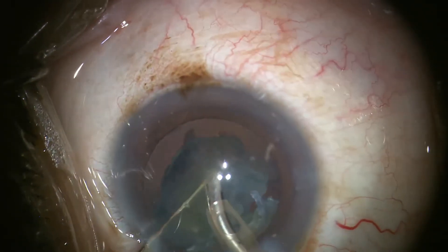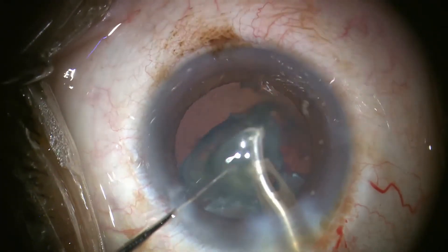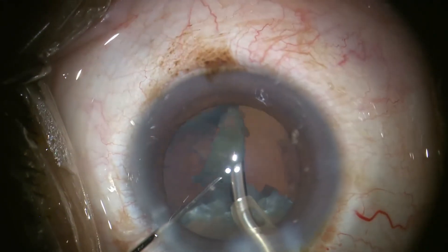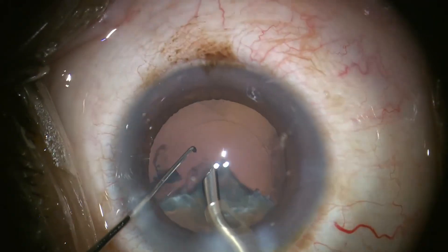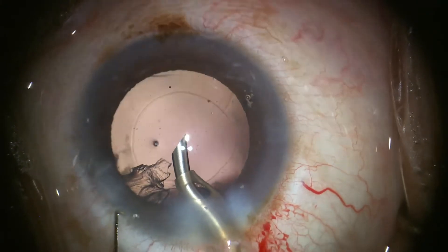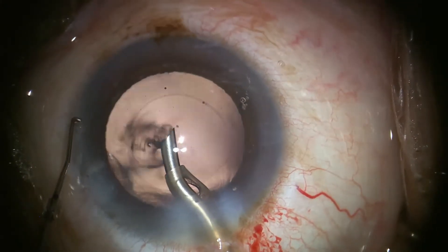If the petals will not bend centrally, then additional sculpting at the base of the bowl may be needed to make the hinge point of the petal thinner and more flexible, although that was not needed in this case. A little rotary motion of the FACO tip and some pressure on the limbus can help liberate nuclear pieces remaining in the angle.